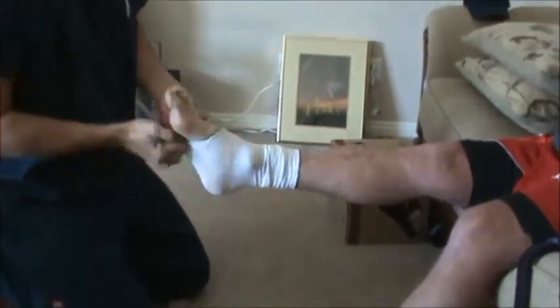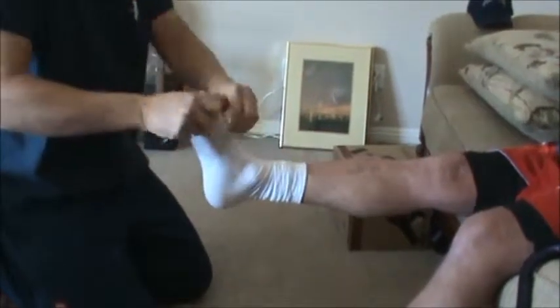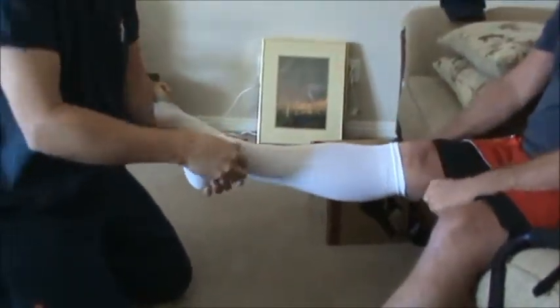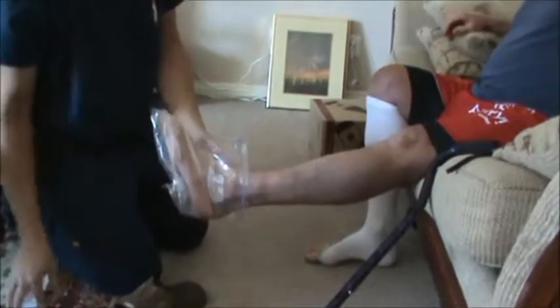Very sticky today, yeah. Then you can pull the rest right on. Make sure you don't have any runs in there — there you go, easy as one two three. Do you want the other foot done next? Let's do the other foot.